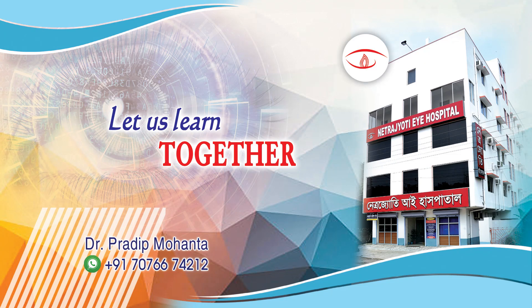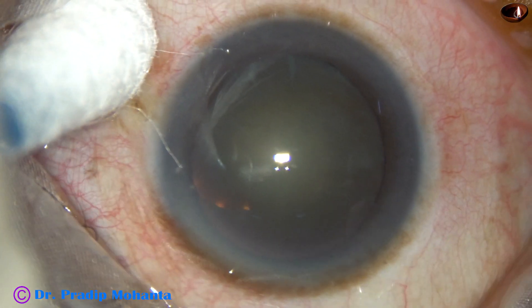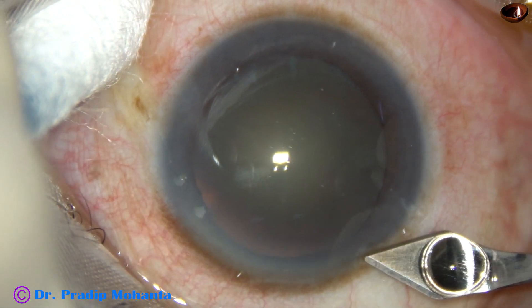Friends, welcome to my workplace at Ranaghat, West Bengal, India. This is a totally unedited phaco-surgery. Let us observe this surgery.